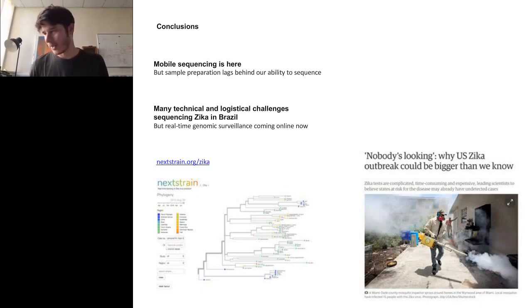And then if we could identify what it was in that way, we could then switch to the surveillance mode, where we could design an assay which was specific for that virus, and it would switch back to the surveillance mode, like we've just been talking about. But certainly we would expect to be able to do these things rapidly, and we have the equipment and the facilities ready to deploy this at the drop of a hat.